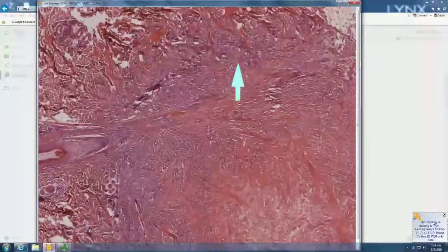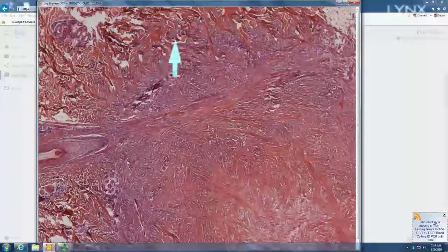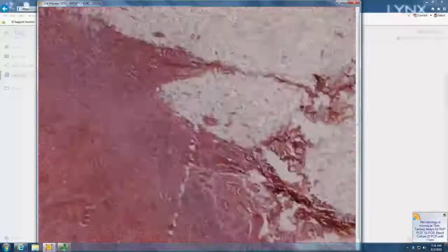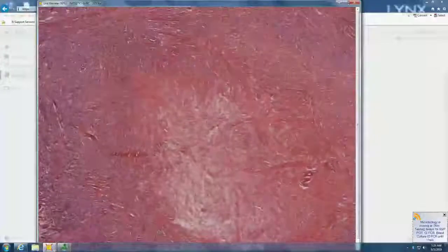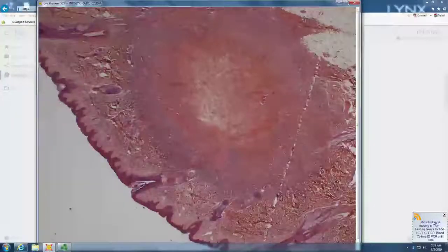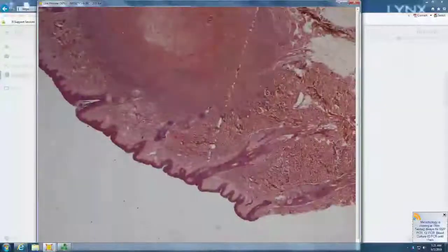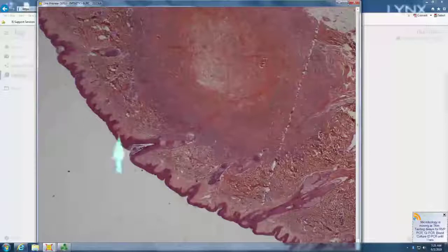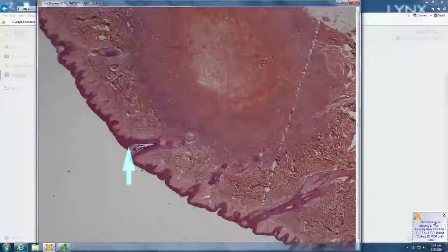Surrounded by more hypercellular areas, you have these at the periphery. A little collagen trapping at the periphery, more hypercellular and then hypocellular areas. And if you compare the epidermis there, which is really quite thin off at the edges, to what's directly overlying it, is it equally thin overlying? Not really. A little bit thicker, right? A little acanthotic overlying. So what do you think?